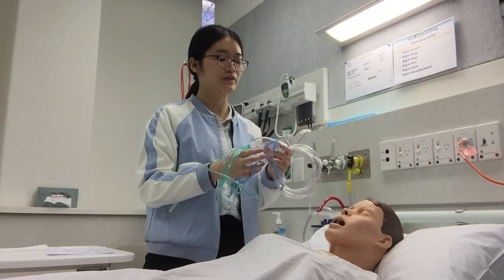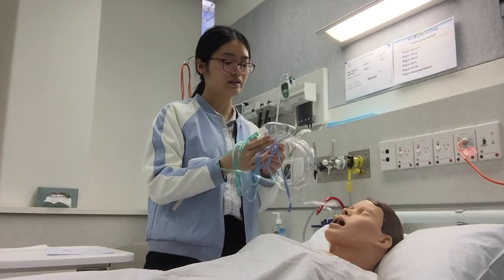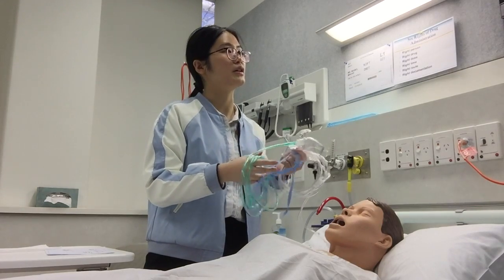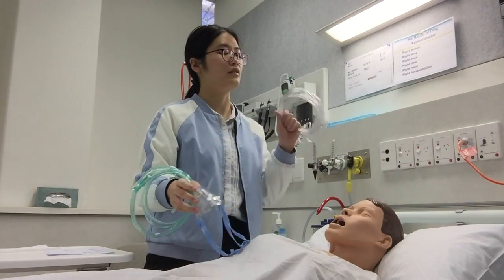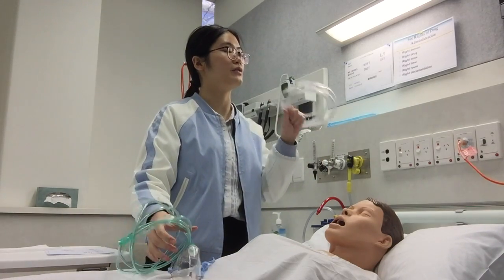So if the patient uses this one for a long time, it is very hard for him to drink, eat, and speak to others. That's why a lot of patients in hospital prefer the nasal cannula.